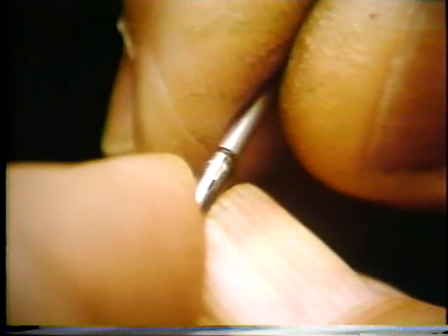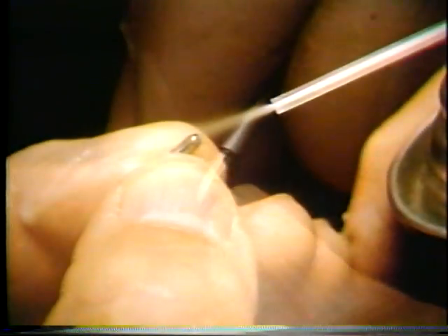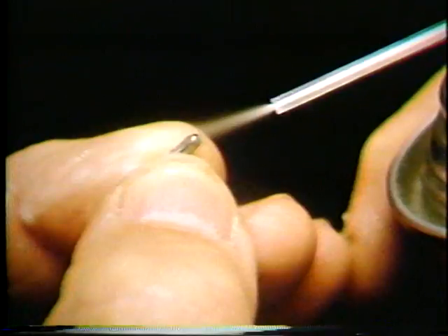Sometimes you'll find that it's hard to get a burr into the friction grip. To avoid this problem, use a dummy burr to bend the edges of the grip part of the chuck out a little. This will create more space for the burr. Apply spray-a-day to both parts of the chuck.